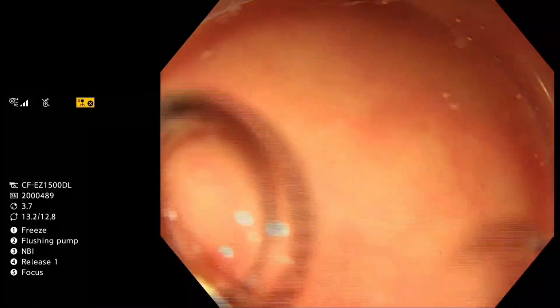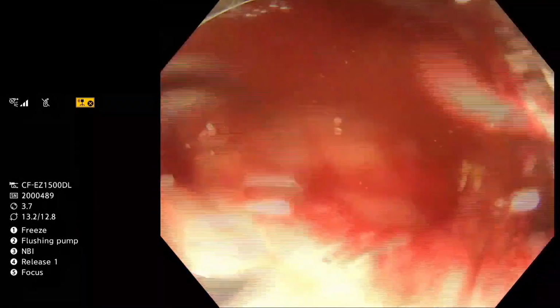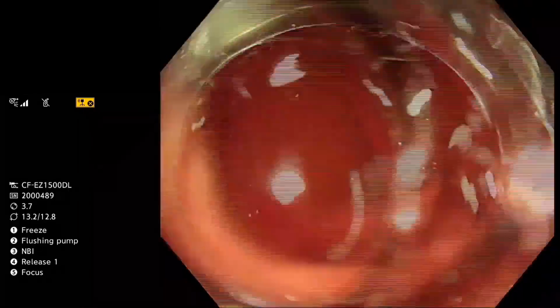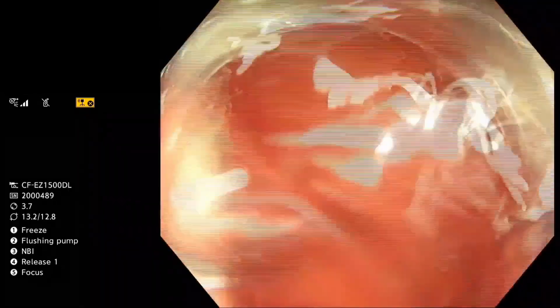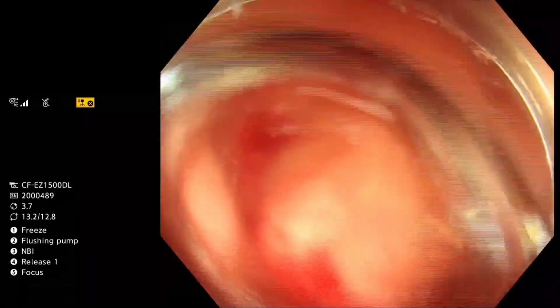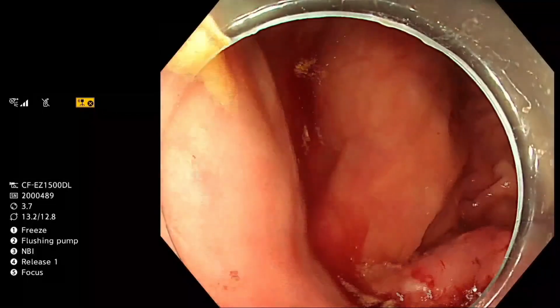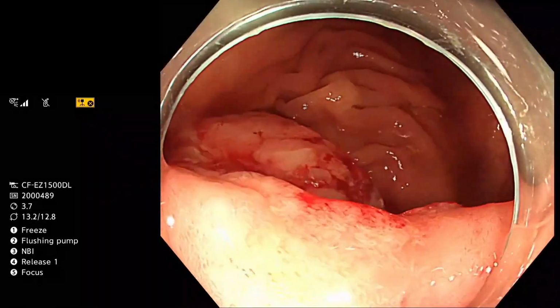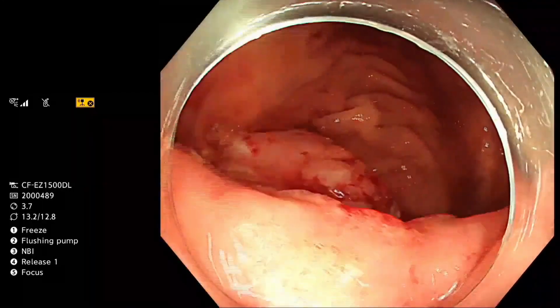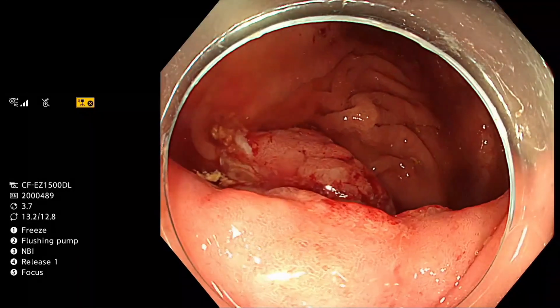You want to always, if you're doing this kind of thing, start on the ileum. Well, you need to find the orifice. Well, yeah, because also if it's extending into the appendiceal orifice, then you need to think about that. Well, the options are full thickness or surgery. And would it be better maybe if it involves both? Probably it's better that the patient has surgery because you get it in one go.